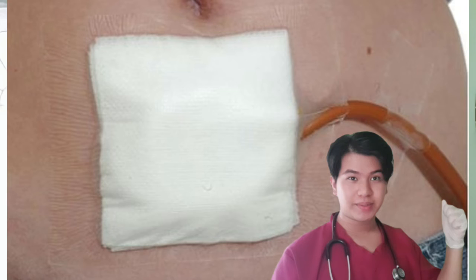Afterwards, you're already done with the dressing, but as nurses, don't forget to always document anything that you've seen. So any condition of the skin, if it shows any irritability, you have to document it and showcase it to your nurse or your registered nurse and report anything if there's anything to be reported. And always put the date of the dressing on your report chart so the next nurse would come in and know when is the last time the patient has been dressed.